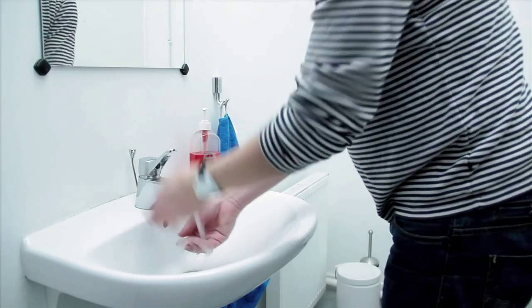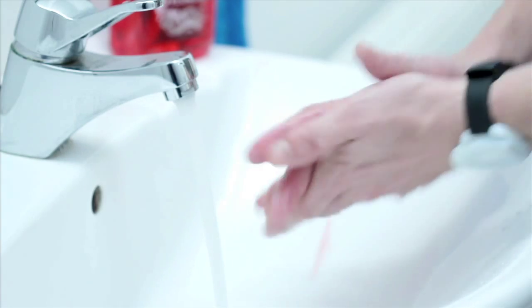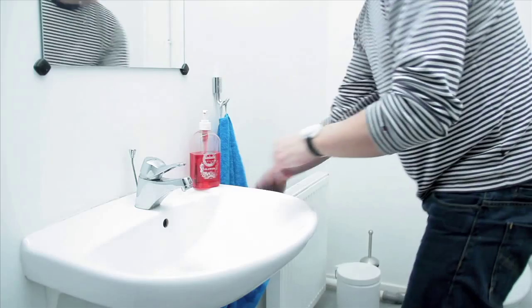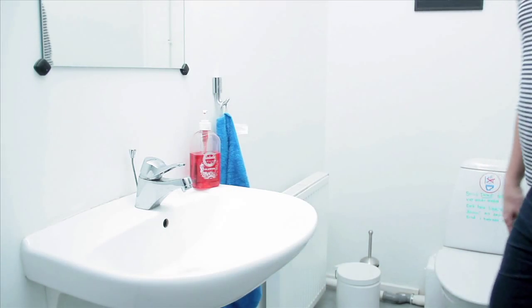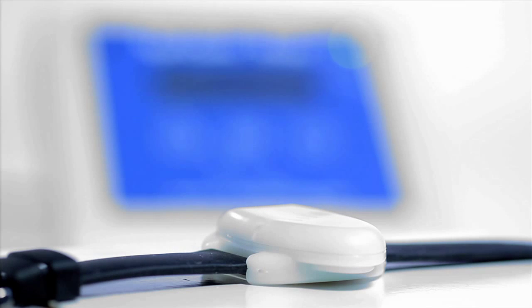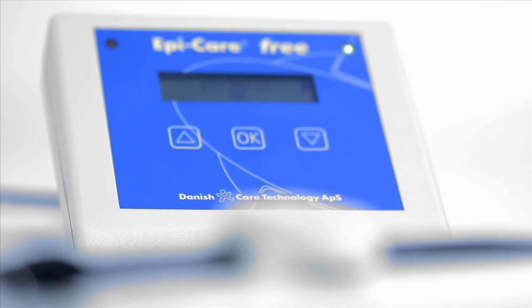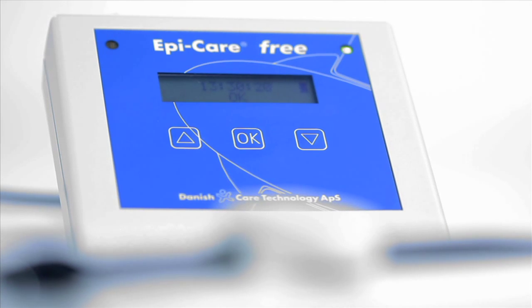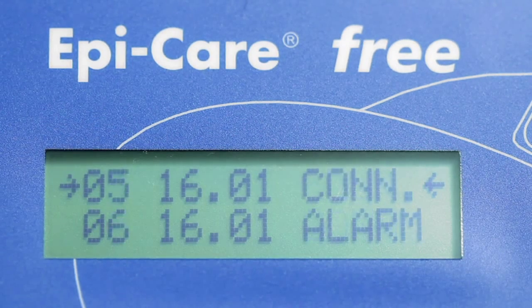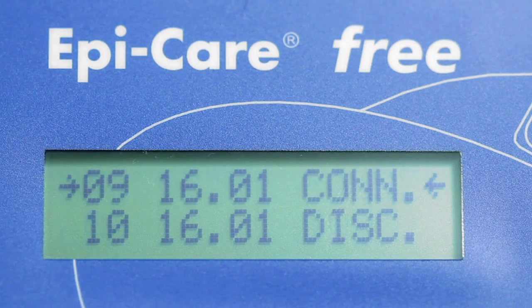The armband can be worn while washing hands, but should be removed before showering. The EpiCare Free device continuously monitors the sensor's battery level and whether the sensor is within range. It also sends a signal if monitoring is interrupted. The control system registers the time of alarm episodes in a log, making it easy to keep a seizure journal.